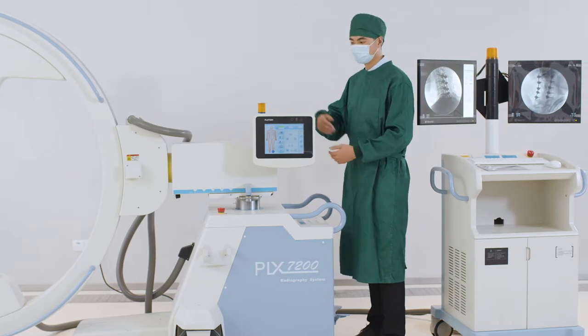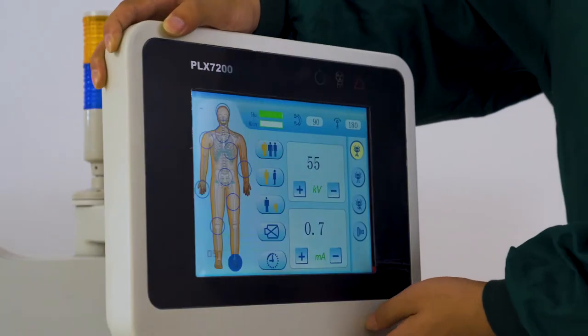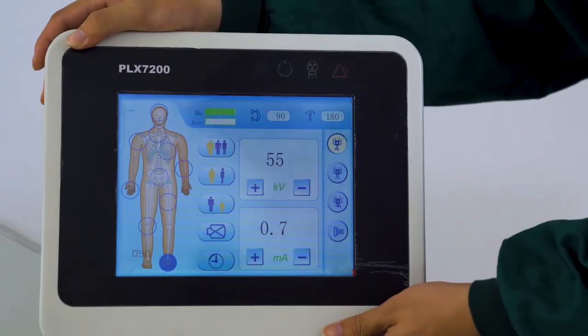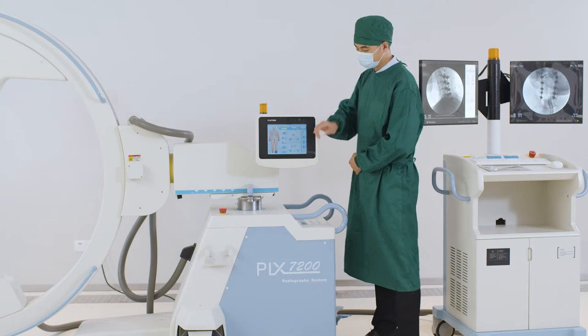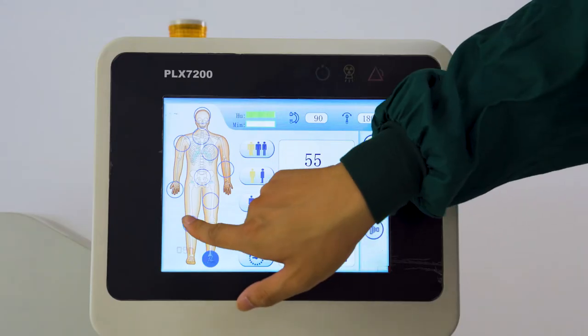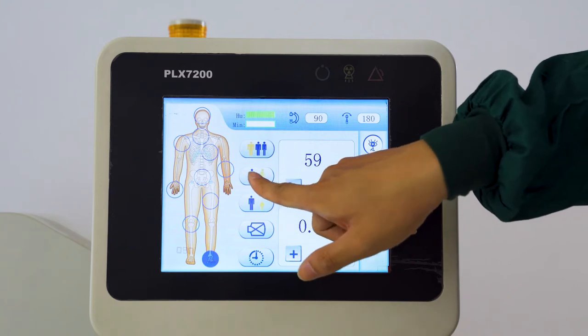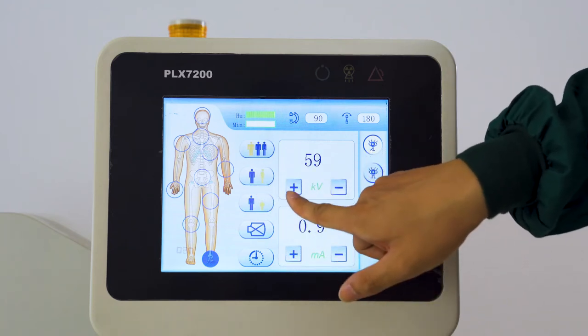The LCD touchscreen can be rotated freely on both sides of the mainframe, with accurate APR parameter settings, smart and fast operation, convenient for operating mode selection, parameter adjustment, and other operations.